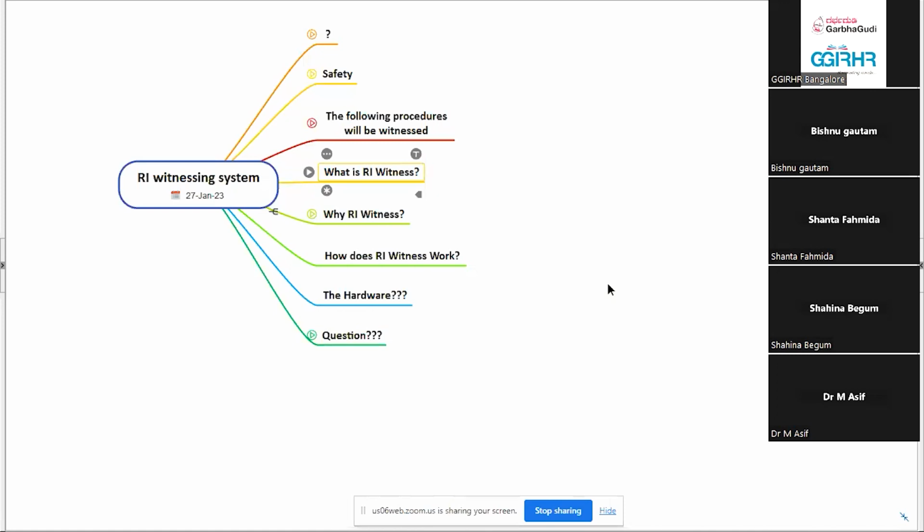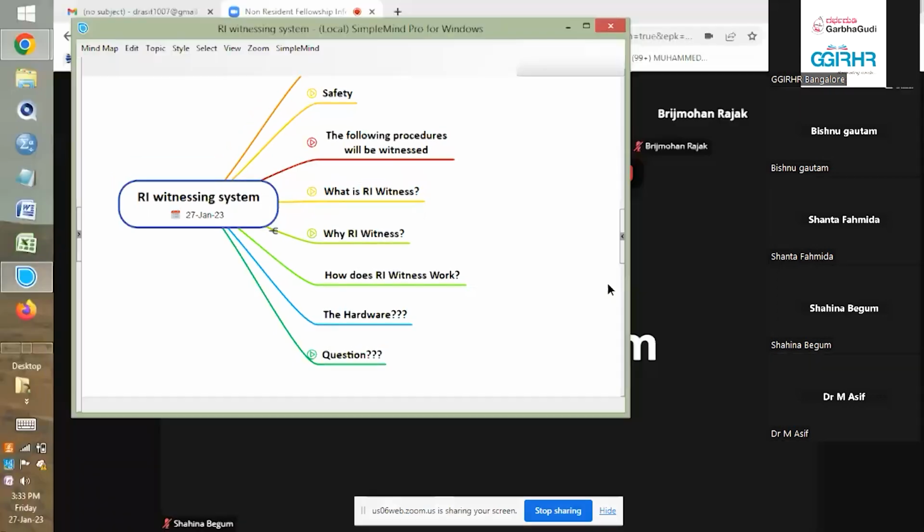Sir, it is a software, I think, and individual for each patient, because each patient will be given an individual number. It is uploaded in the system somehow, and it will monitor the total work, the total system of that particular patient individually. Excellent, madam. Very nice answer. Can anyone add something a little bit more? Can you add any further points?